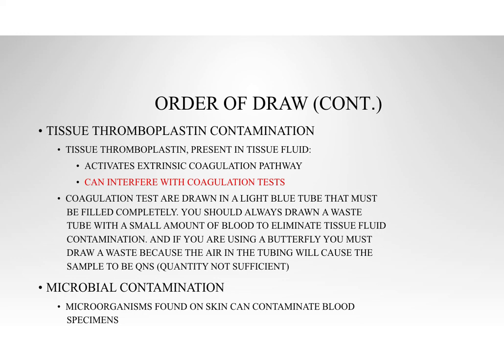Because remember, those evacuated tubes pull a specific quantity. So if part of that quantity of blood that's going to get you to that sweet spot is filled with air, you're not going to make it. It's going to be quantity not sufficient every single time, I promise. Okay? So drawing that extra tube allows us to get rid of those two issues.